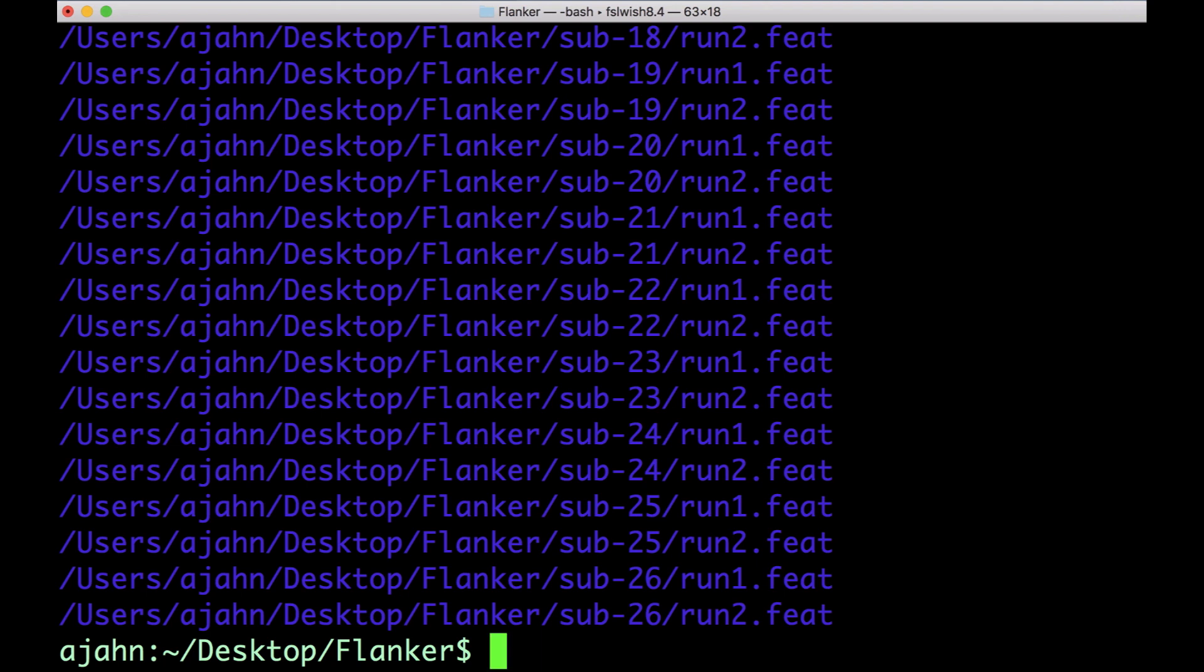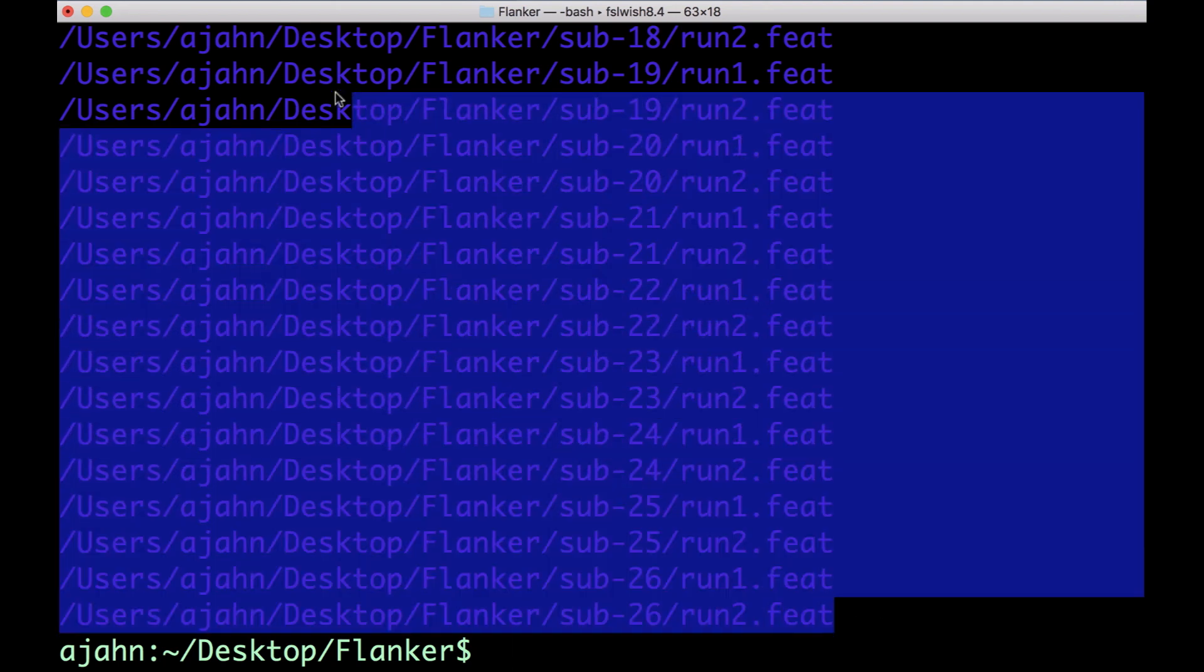This creates a list with 52 entries, one corresponding to each run for each subject in the study.